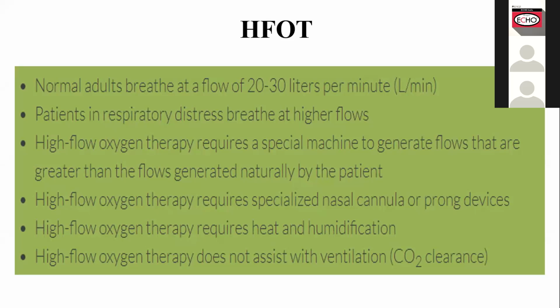High flow oxygen therapy requires a specialized nasal cannula or prong device. It means it's not every single device that can give high flow. So high flow oxygen therapy will require heat and humidification. This will decrease the mucous membrane irritation and dryness, so that it cannot harm our patient.